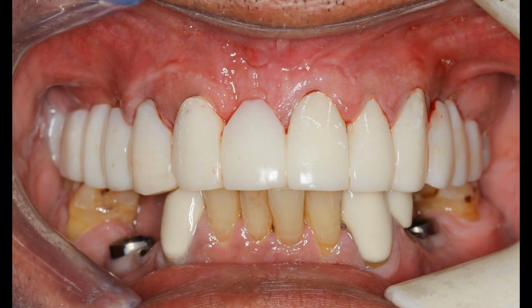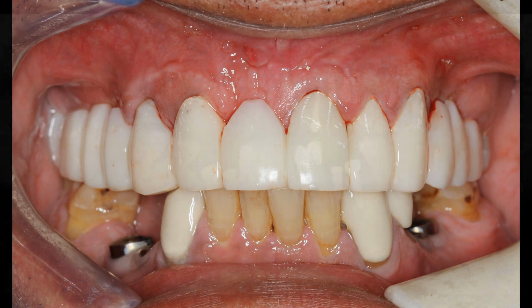So here's his first temporary that I gave him, gosh, must have been 2010 or so. He wore this for way too many years, 10 or 12 years. We might have remade it once. Too busy to come in for treatment.